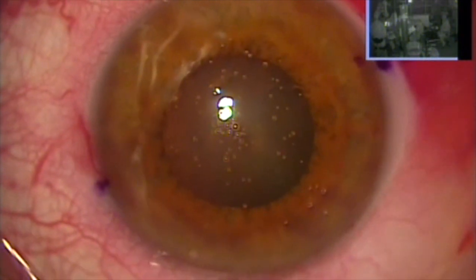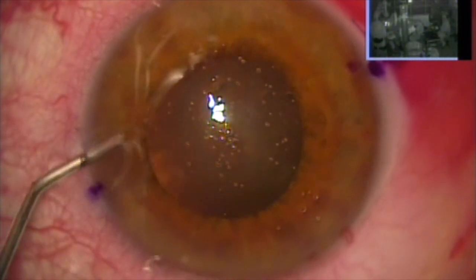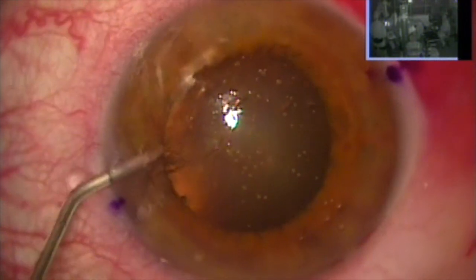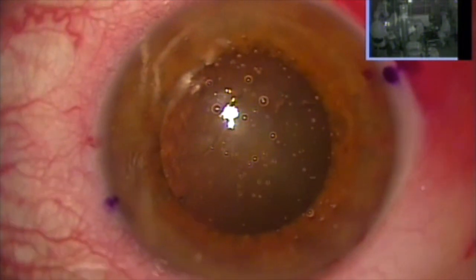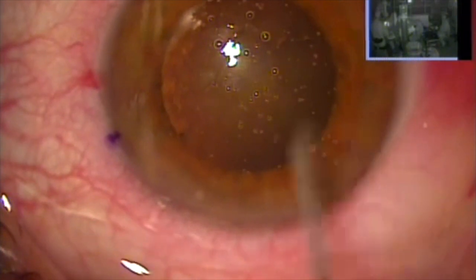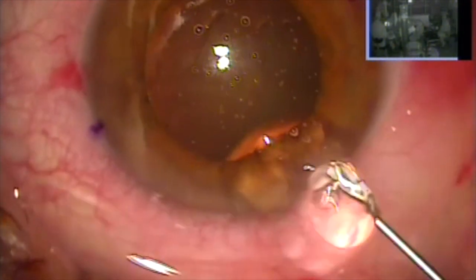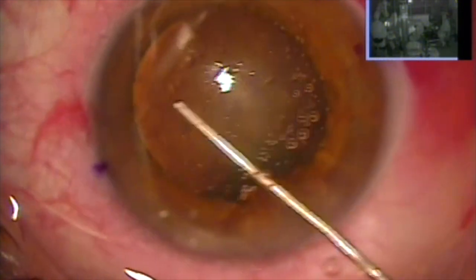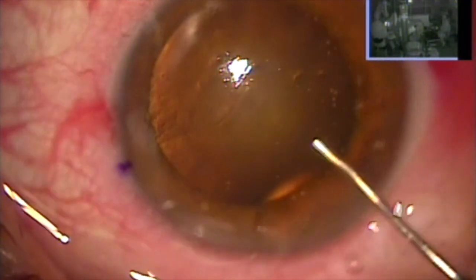So we're going to use some epinephrine to attain further dilation. The fact that the pupil moves with the fluid tells me that it's going to stretch quite a bit. A few inadvertent bubbles here, but once we use our magic gel inside the eye — Viscoat by Alcon, my favorite as it gives maximum endothelial protection — we'll see that we're now dealing with a completely adequate pupil diameter.